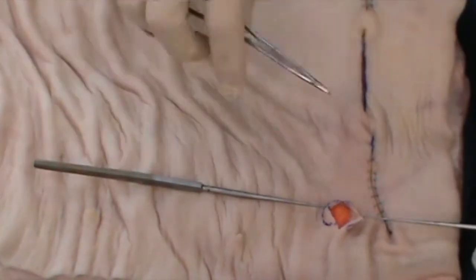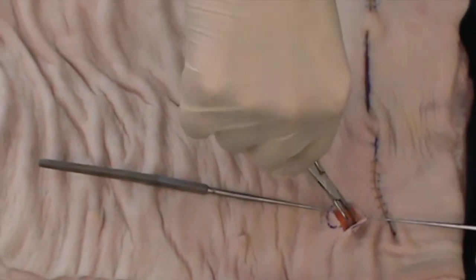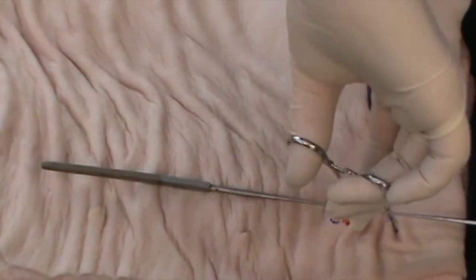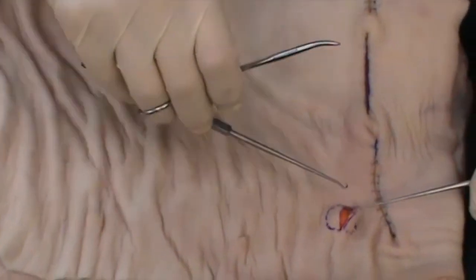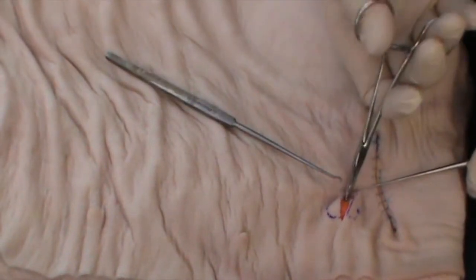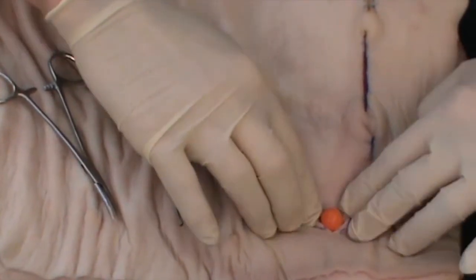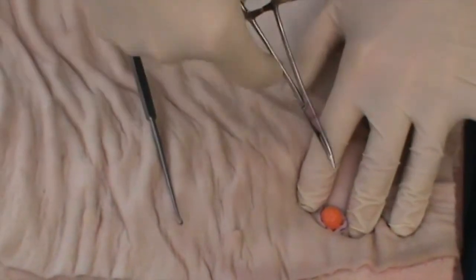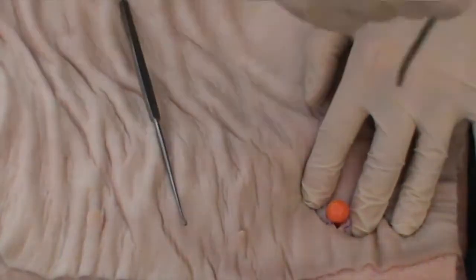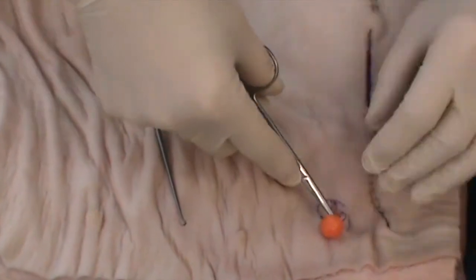Whilst removing it, I often use blunt curved artery forceps, gently working around the cyst wall — taking care not to rupture it if at all possible — in order to work underneath the cyst, because it's here that it is often at its most adherent. Sometimes it can help to put a little bit of pressure on either side so that the cyst is exposed, and in this position you're able to see what's happening underneath. If necessary, use your curved blunt strabismus scissors to release the cyst from underneath.